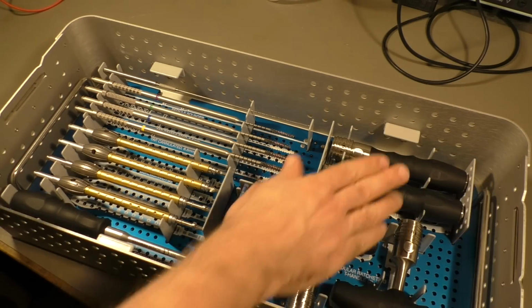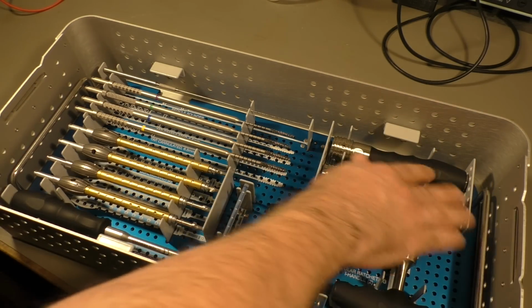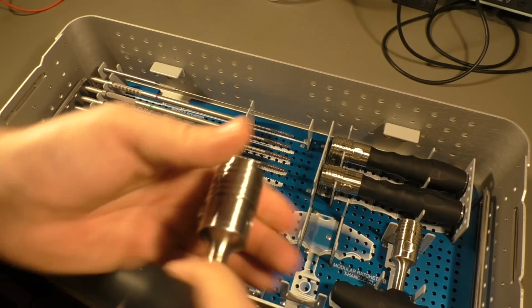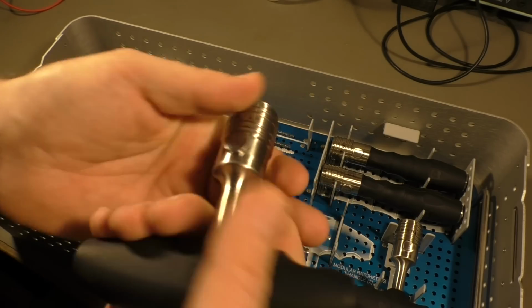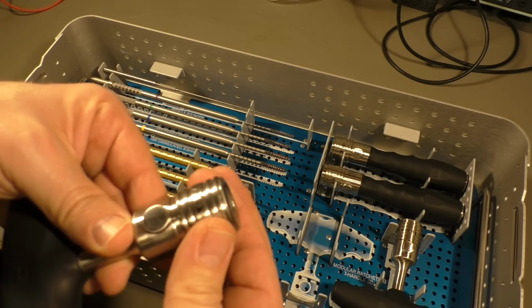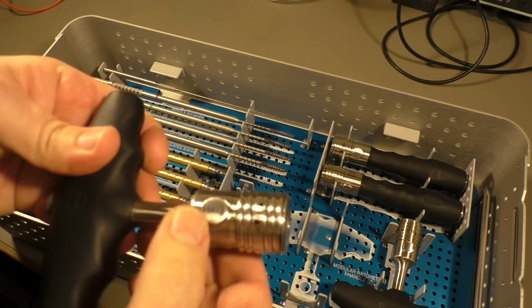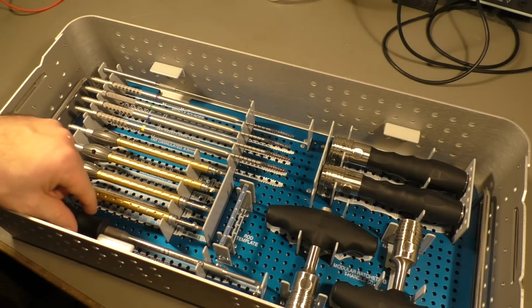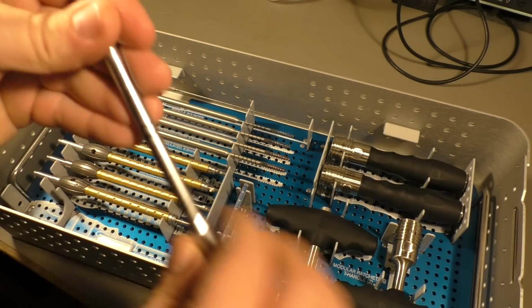We have two handles, straight ones, and two T handles for more force, maybe for the bigger threads, with the same mechanism: ratchet, forward, backward, release button. Then we have a screw remover.